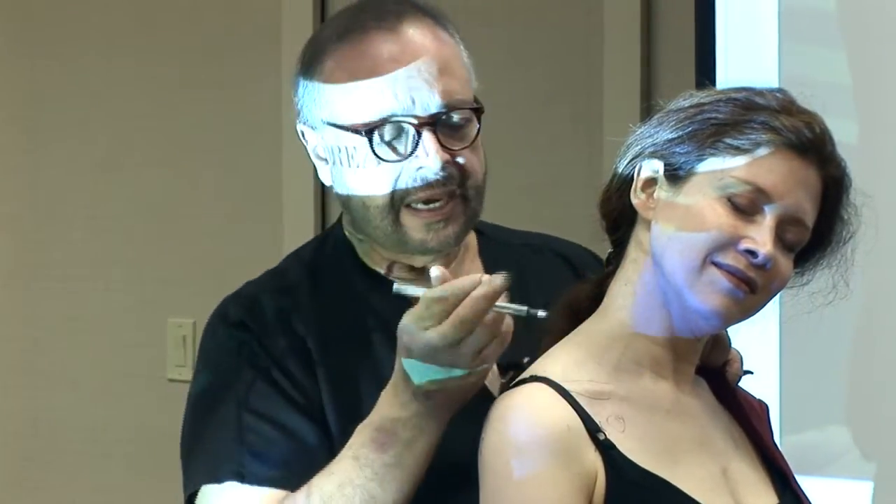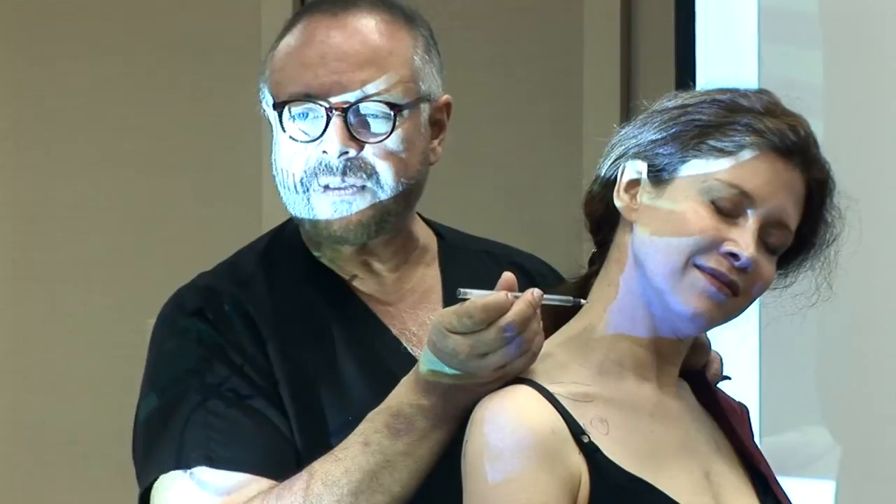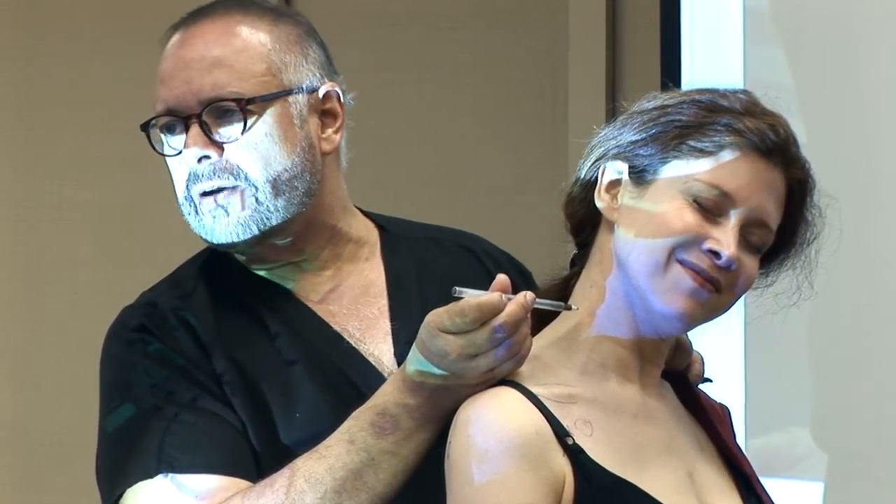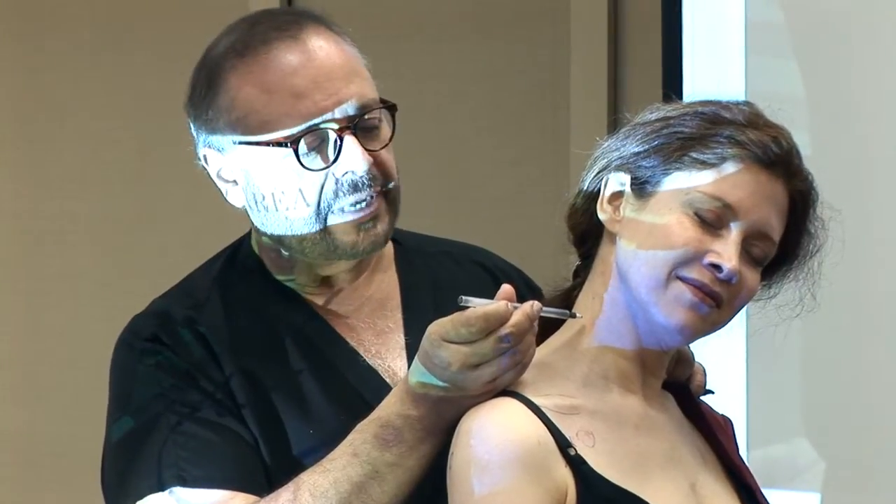I come further down and say: 'We're going to do the same thing — on the count of three.' Now she's expecting me to inject on one, so this time I say 'one, two' — and the needle is in. Varying the count prevents the patient from anticipating exactly when the injection will occur.